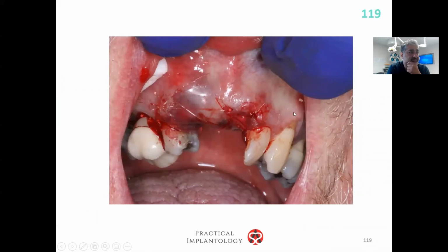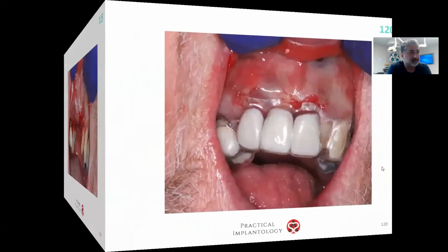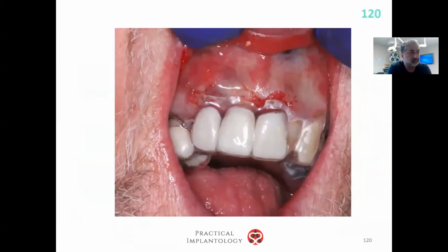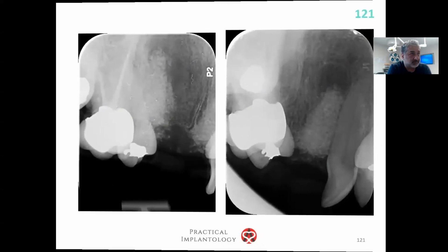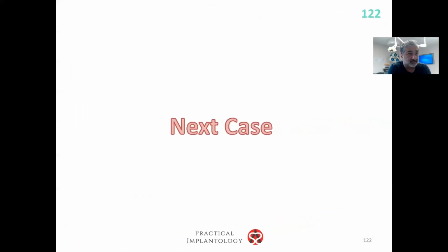Okay, you suture it with a 5/0 suture, and you just gently go through, twisting the suture. And if you come to the hands-on, we'll do some practicing with that. And then my Essex retainer on top. Beautiful, beautiful. And I'll try to show the CBCT in 6 months' time on my Facebook, and you'll be able to see bone regenerated in that case, hopefully.